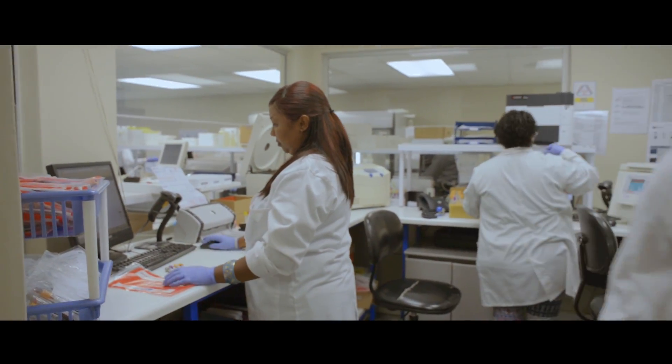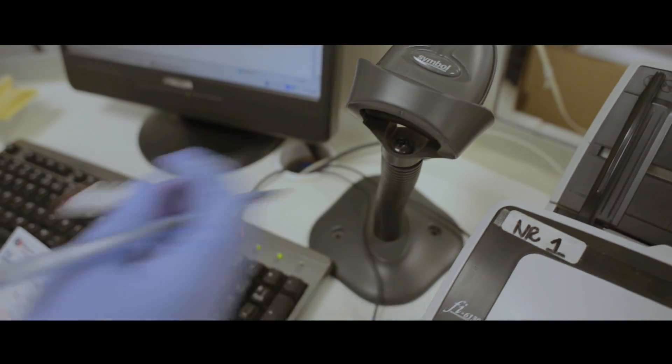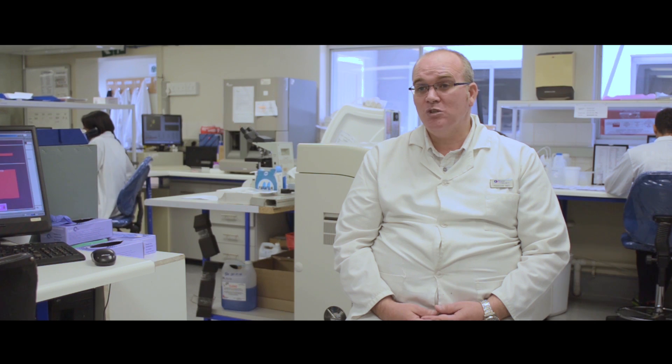They would unpack the samples, check the name and that barcoded number on the tube to see that everything corresponds. They would then, depending on the kind of test that it is, need to spin it down.